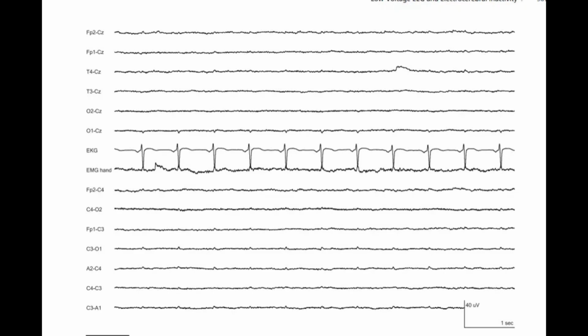But is there a pattern that means there is no brain activity? Yes, there is. It's called electrocerebral inactivity, or ECI for short, sometimes also referred to as a flat EEG. So that means like no brain waves at all. Exactly. No detectable electrical activity, which, when confirmed using really strict criteria, is consistent with brain death. So that's like the ultimate silence of the symphony. Very profound. It really makes you think about how important those electrical signals are, for everything we do, think, feel. Our whole existence.